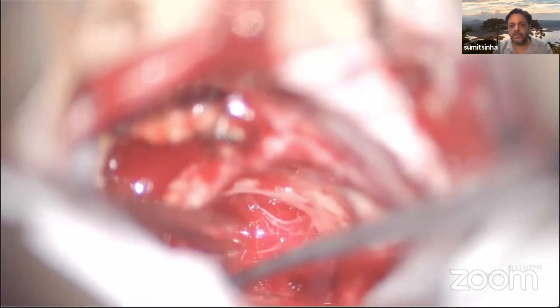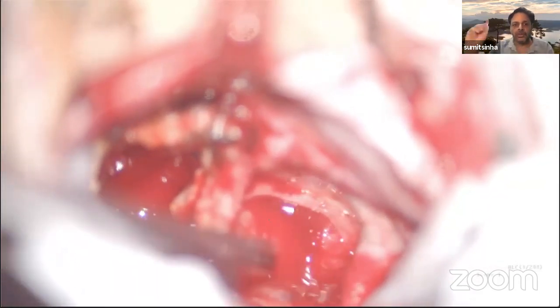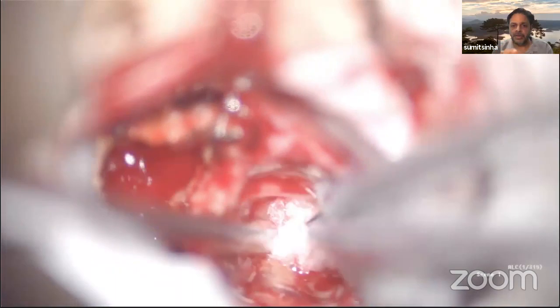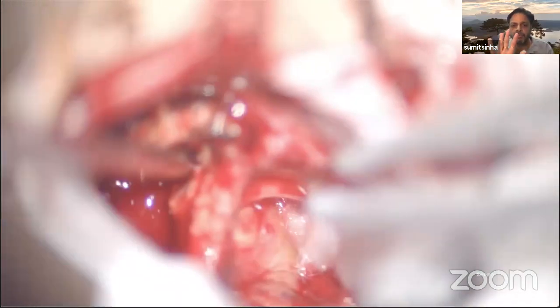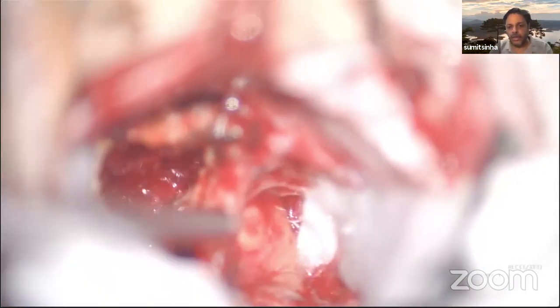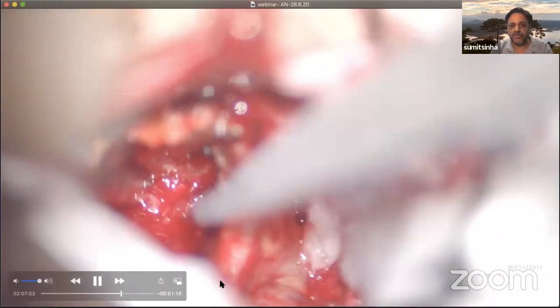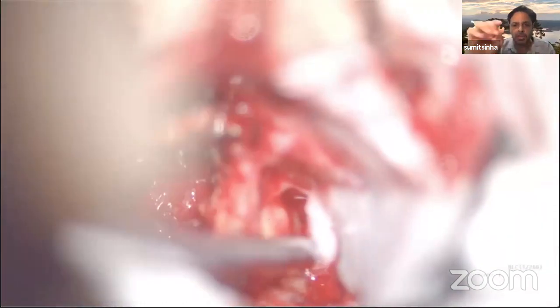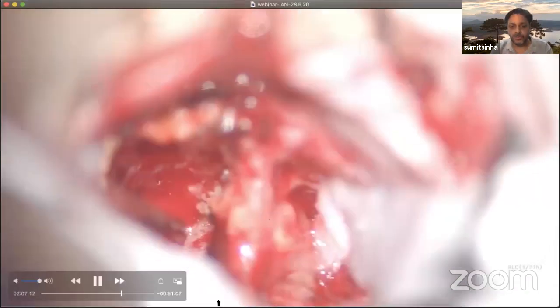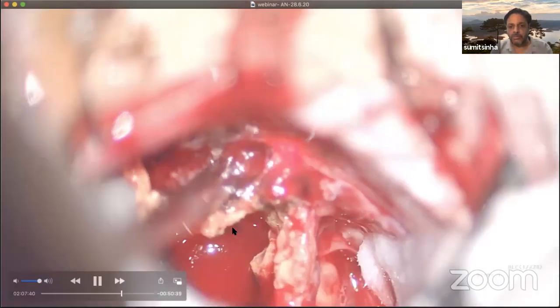Now, if this happens, you have to immediately stop, because this signifies an irritative injury to the facial nerve with consequent poor outcomes in the postoperative period. When this happens, you have to stop a bit, irrigate with saline, and leave the facial nerve, and you are allowed to proceed only when this train of impulses stops after your handling stops. This is a sign of irritation of the facial nerve. And if the trains keep on coming, then your facial nerve is probably not going to do well after your surgery. So this is a particular small technical nuance that you have to keep in mind during acoustic tumor surgery.